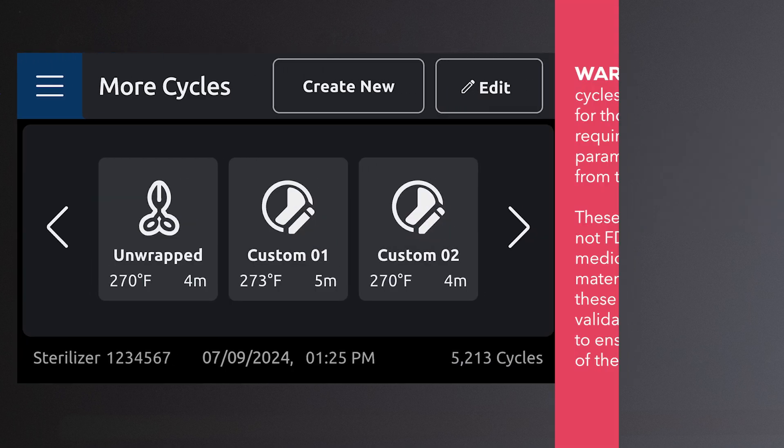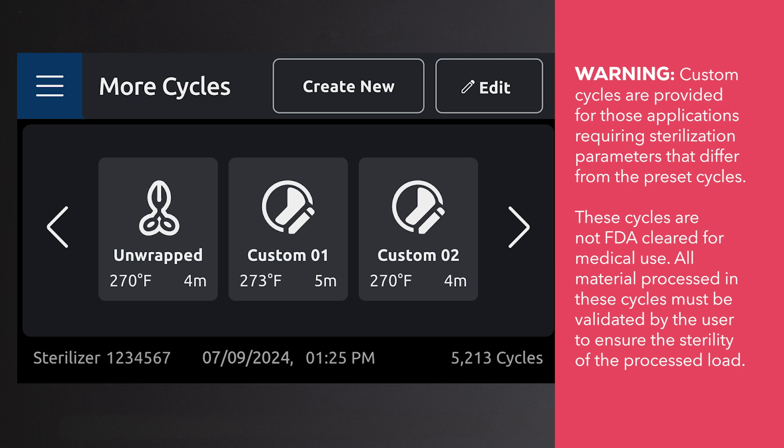Custom cycles are provided for those applications requiring sterilization parameters that differ from the preset cycles. These cycles are not FDA cleared for medical use. All material processed in these cycles must be validated by the user to ensure the sterility of the processed load.